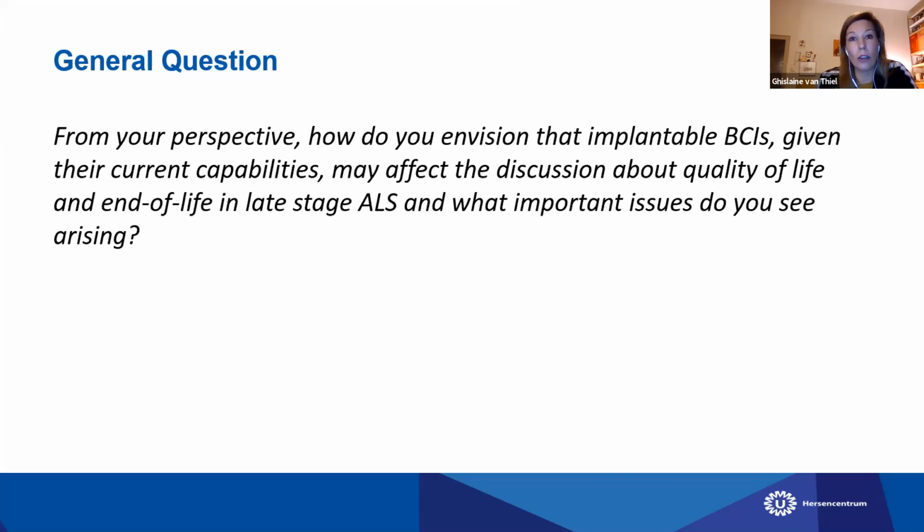In addition, with the technology itself, we try to make people more independent, but it creates other dependencies than there were in the first place. So it may also create dependencies that were not there yet, and may affect not only the patient but also the caregivers.